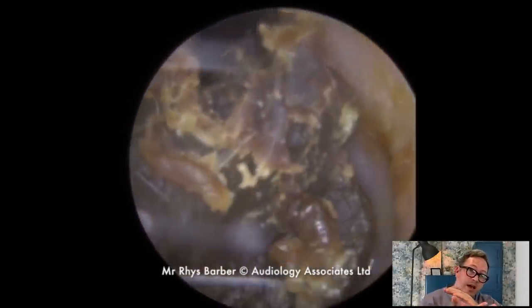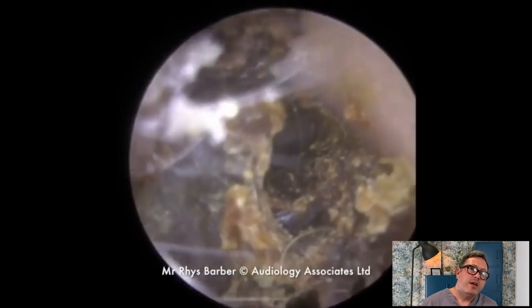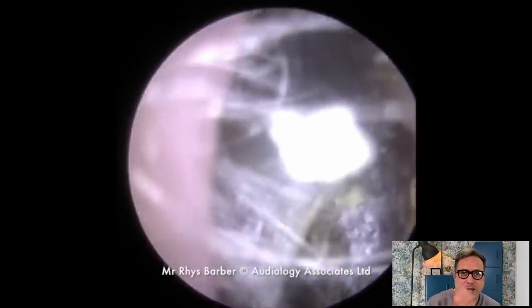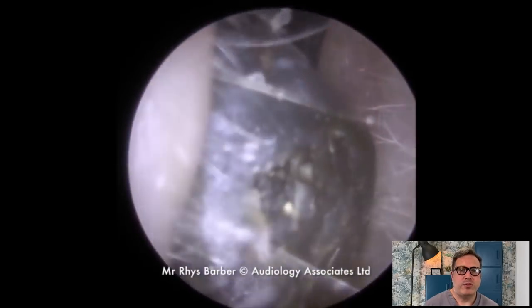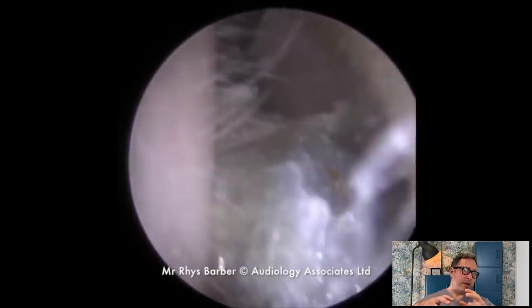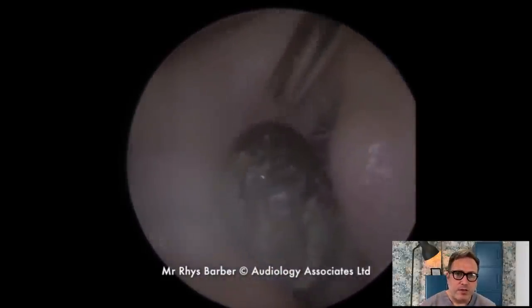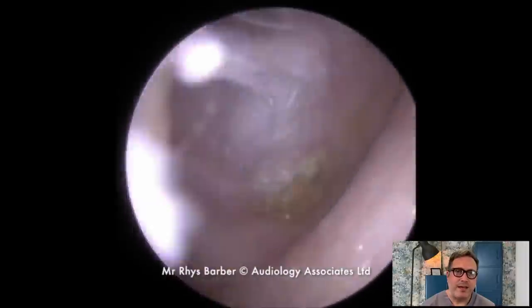As we get a bit of pressure behind it, it just starts to sort of move and flicks away. Now we're rolling it — now it's moving. So we're rolling this all the way down. You can see that gray material around the outside is also dead skin where this has been trapped against the canal walls and hasn't really been budging. So you've got a bunch of dead skin surrounding that as well. Going to lift this up with the standard size Zolna tube.